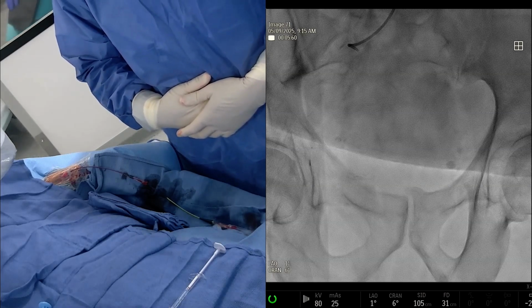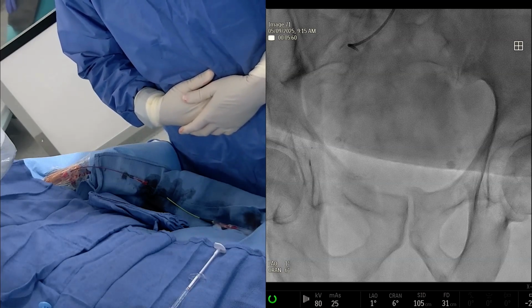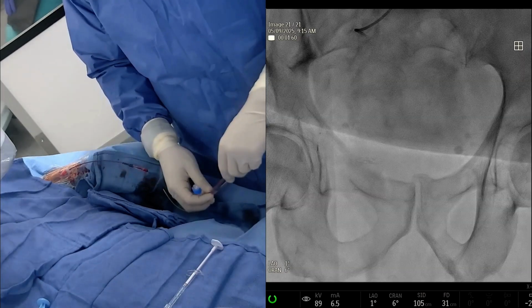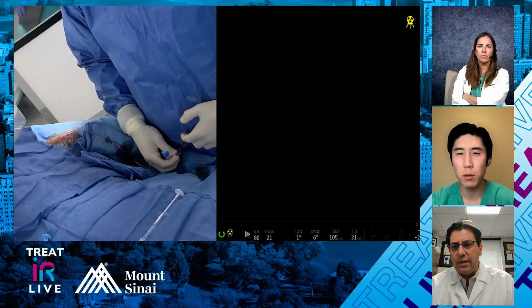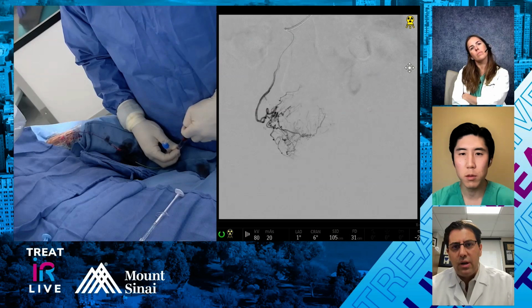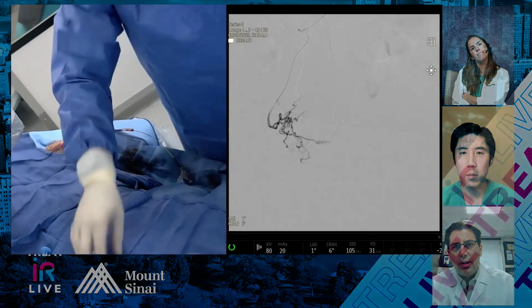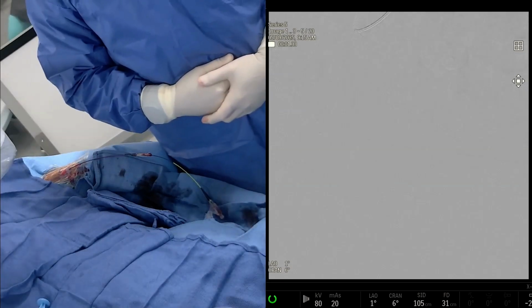Sometimes with these angles it can be challenging, but we were able to very quickly navigate through that long trunk. So, would you guys classify this as a type 1 artery? I probably would. But it's not coming off the vesicular. Wouldn't that make it a type 2 possibly? Because you called it a common trunk, but it has a pudendal, vesicular, and a prostate. Yeah, it could. I don't disagree with you, Art. I don't think it really matters. But the bottom line is we see a very large artery with a long trunk.